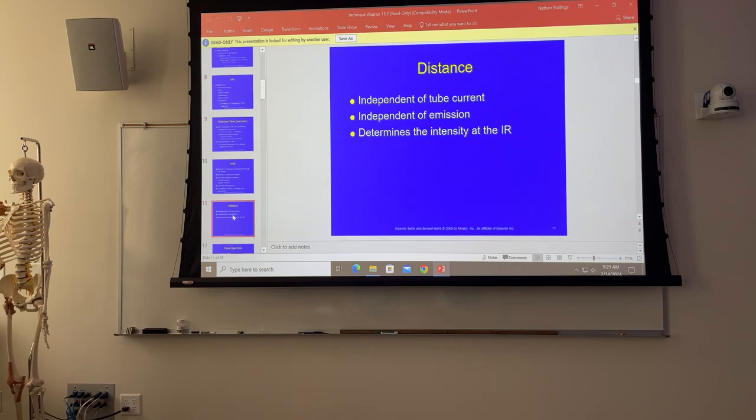So you're doing a portable chest x-ray on a patient, you set a technique, you shoot your original at 40 inches, you back up to 72 inches. What's going to happen is that if you don't change the technique, you're going to have a reduction of photons striking the image receptor. I wrapped up on Friday with a combination of two things, all right?